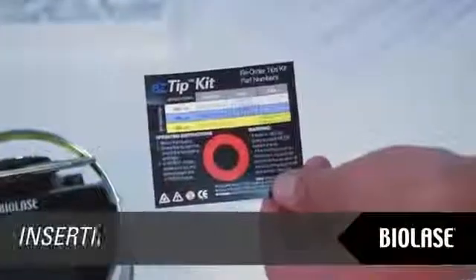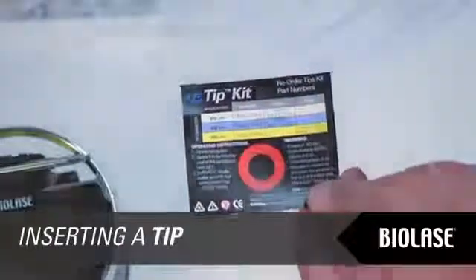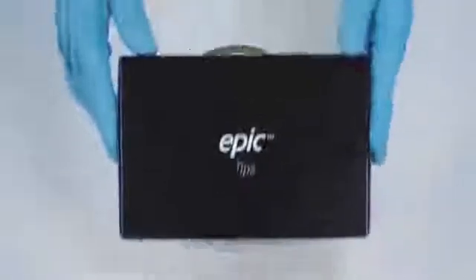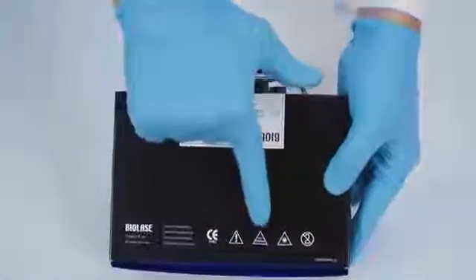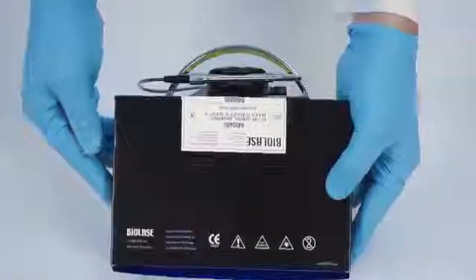Non-sterile tips for the EPIC are available in three diameters — 200, 300, and 400 microns — for applications in endodontics, periodontics, and general soft tissue surgeries. Refer to your EPIC tips packaging for special clinical applications. The tips supplied for the EPIC are not sterile and the packaging is not suitable for autoclaving. You should sterilize your tips in an autoclave prior to use. Recommended cleaning and sterilization specifications are found in the user manual.